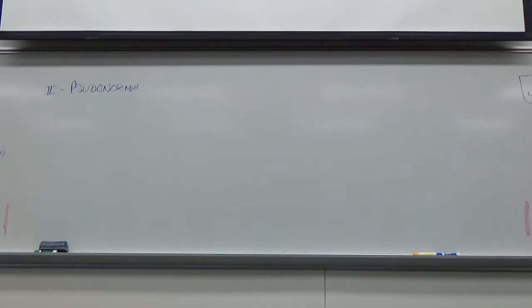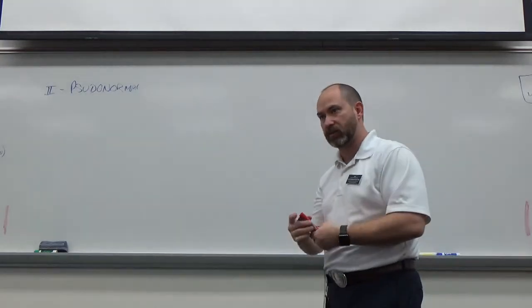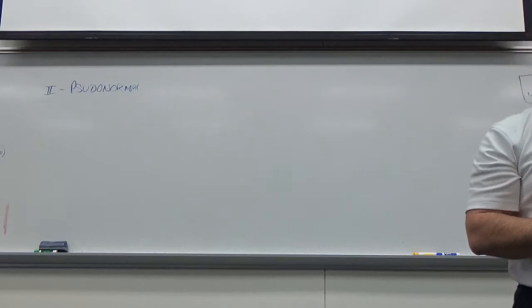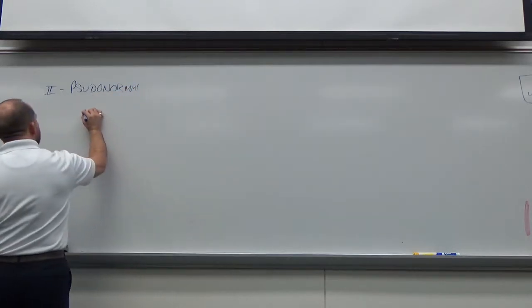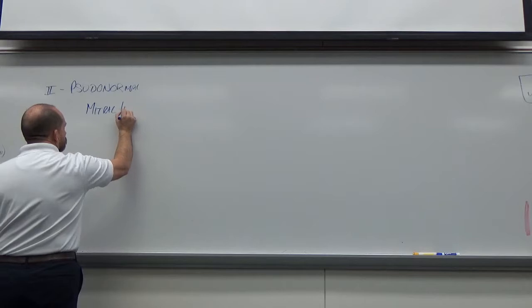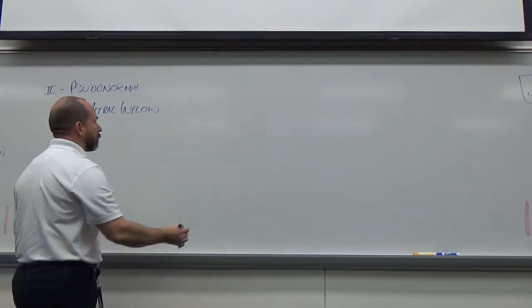All right, so pseudo-normalization. What does pseudo mean? False. False normal, so it looks normal, it's deceiving. The term that I used before is called unmasking. I want to take the mask off and show what it really is. So first of all, mitral inflow. What do we see on mitral inflow?